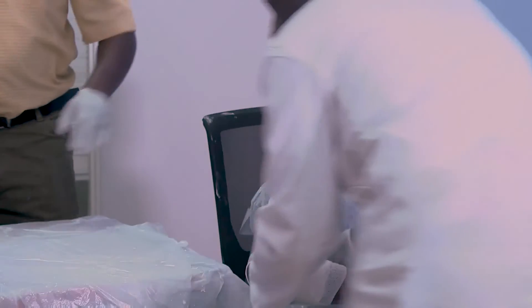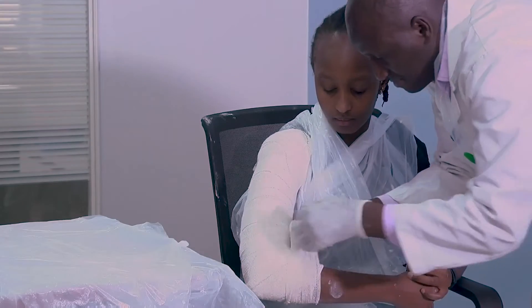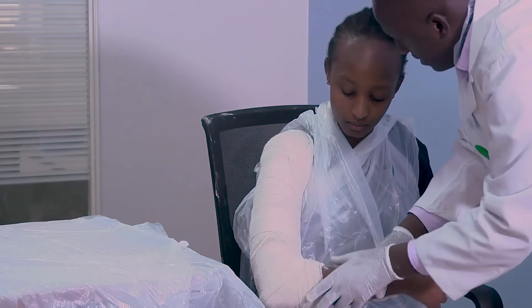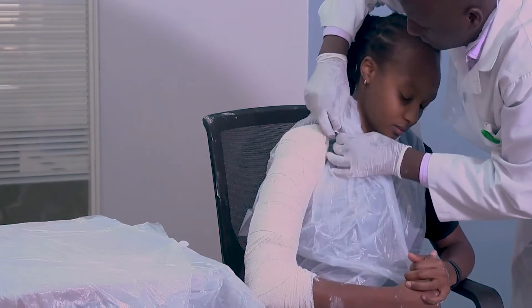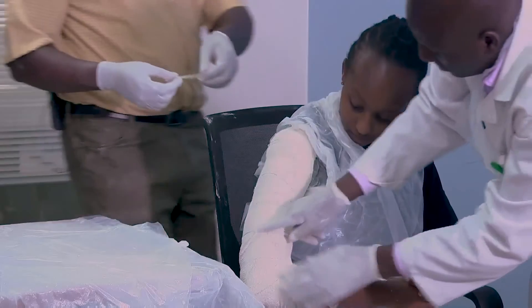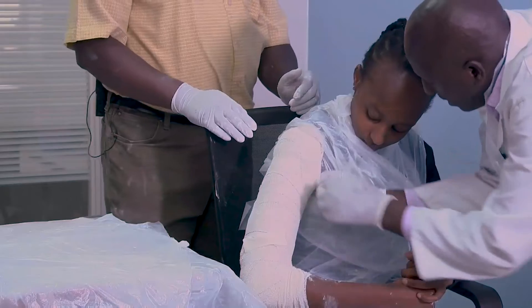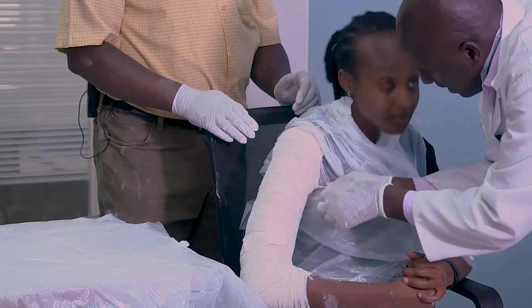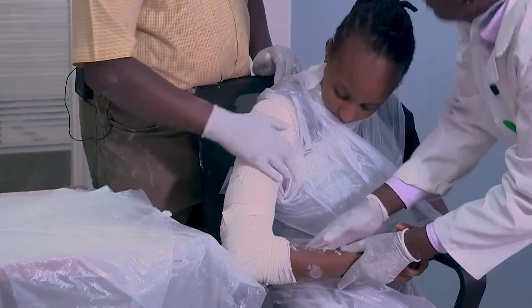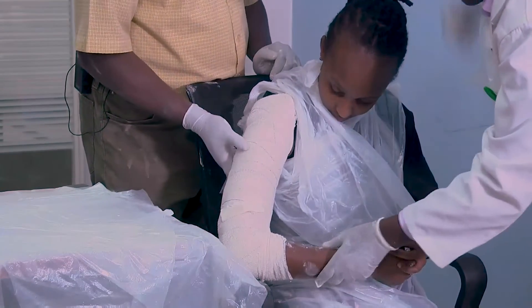Then you can get a strapping to secure the edges. Fold and make sure the edges are covered. Secure your crepe bandage there. Ensure that if you press enough, it could cause swelling, so you don't want to be digging into the axilla. You can see it goes all the way up and all the way down to the axilla level.